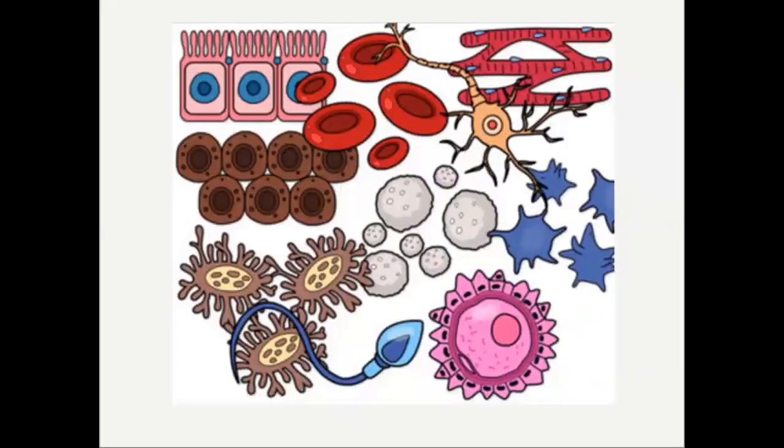In our body, there are many different cell types. They are of different shapes and sizes. That itself is the guide that helps us to differentiate these under the light microscope. So, the basic principle is that you have to look for the nuclei and the cytoplasm when you look at a histology section, and then we can work out depending on the characteristic features we see there.